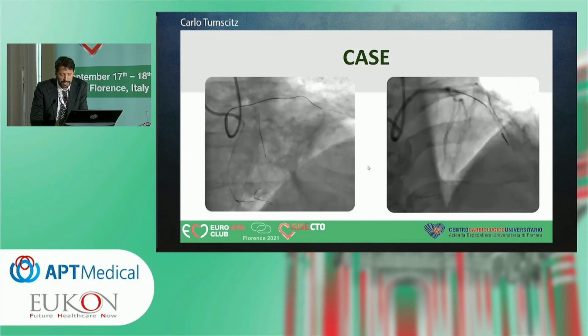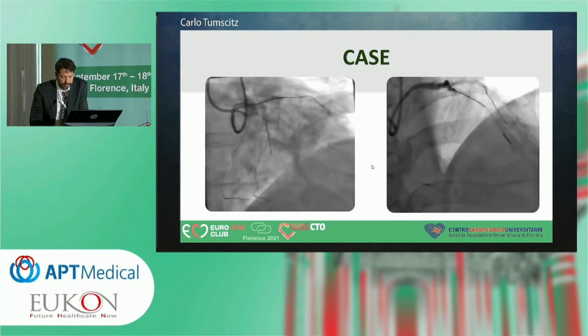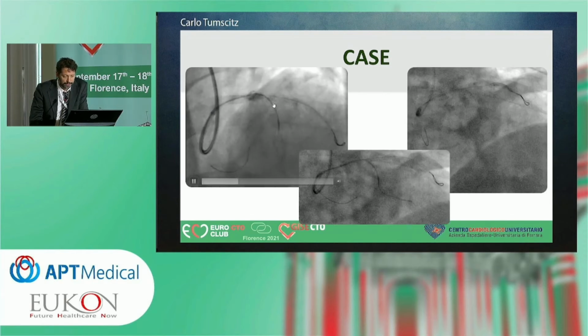And that was another false image, because we spent another 20 minutes to 1 hour trying to go down. No guide wire was able to go. So we assessed the microchannels a little better and found a septal to septal going directly to the LAD, which was the only other choice we found there.